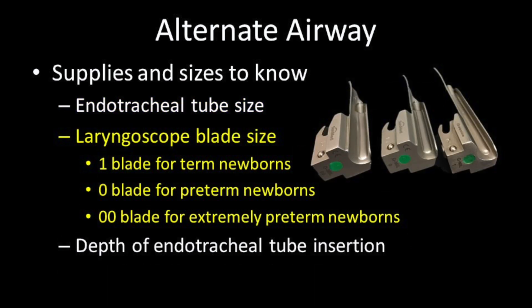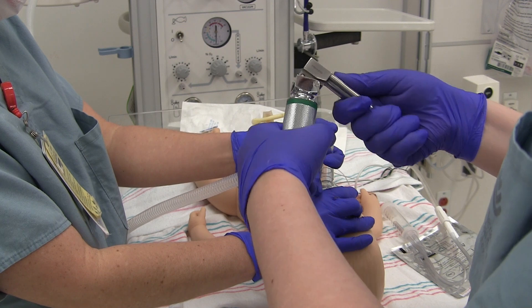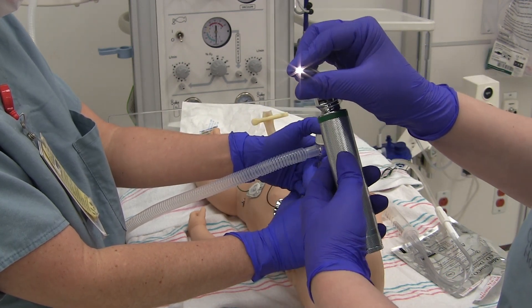The choice of laryngoscope blade size is less exact and chosen on overall size and maturity of the baby. A 1 blade is for term, a 0 blade for preterm, and a 00 blade is used for extremely preterm. Attach the blade by pulling down on the handle and then lifting up. Be sure to check the light to make sure that it is working before you use it.